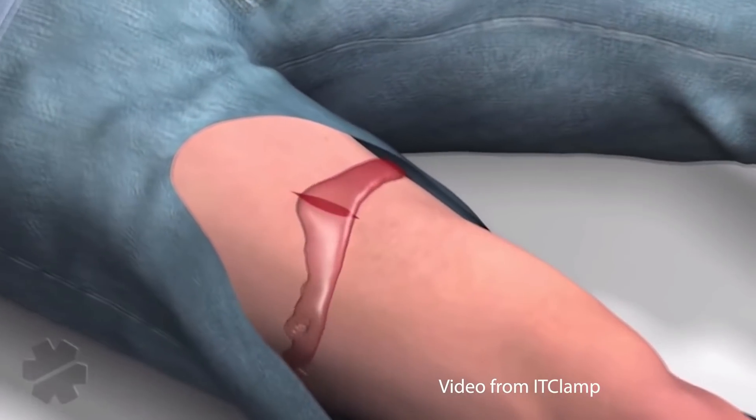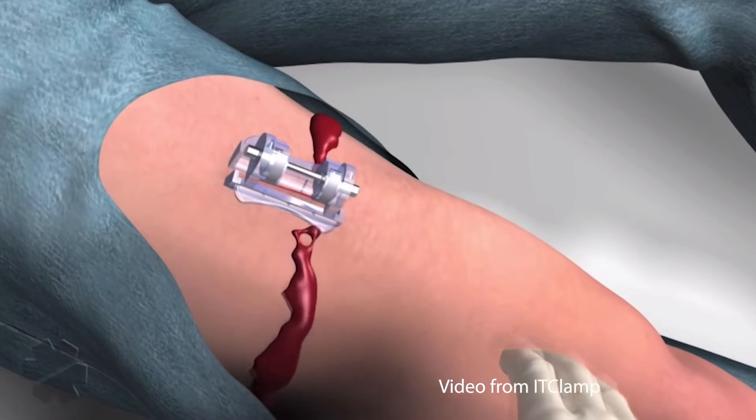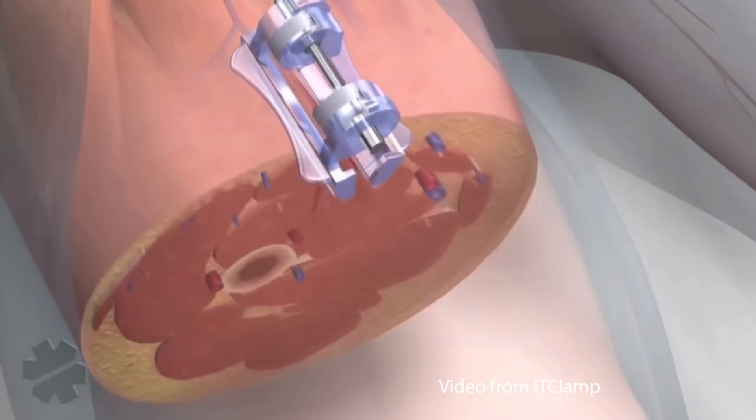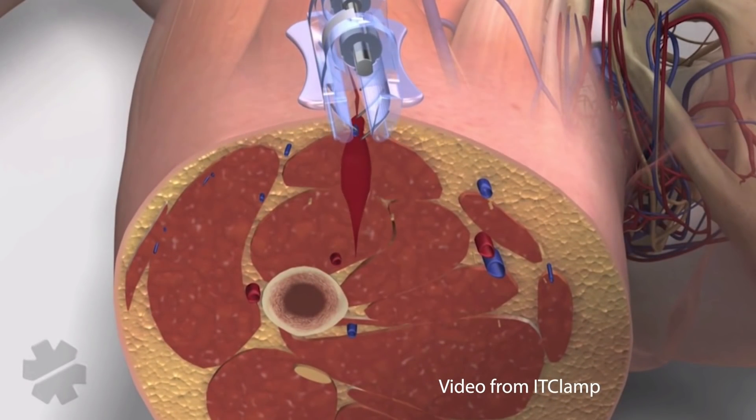The thought is that while this closes the skin above it, it will create a pocket underneath. It will continue bleeding a little bit, but that pressure will eventually stop the bleeding underneath this device. Occasionally you'll have to use two of these if the wound's really long, but generally speaking, one will be enough.